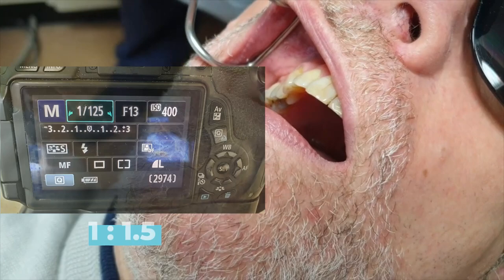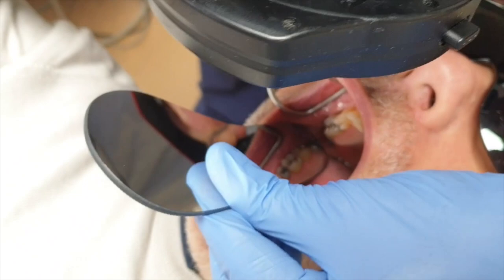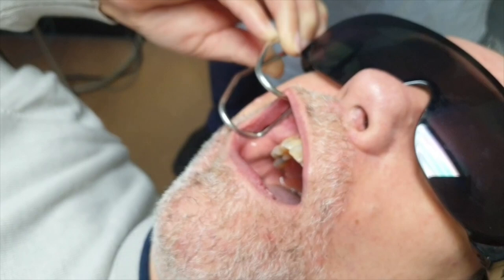I'm setting my camera to a one-to-one magnification. Now I've got this in position — show me the biggest opening that you can manage. So I'm zooming in, I'm perpendicular to the mirror, and that's going to come up lovely. I'm happy with that. I'll share my camera settings on screen shortly. Now if I want to go to one-to-1.5 magnification, you'll see the difference, so I'm going to adjust that in a bit more.